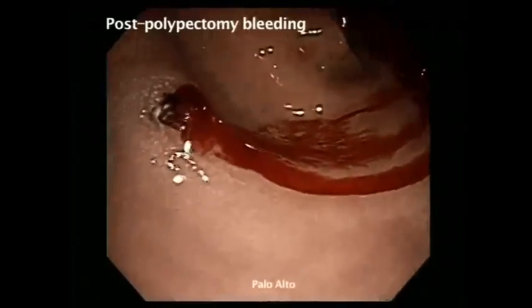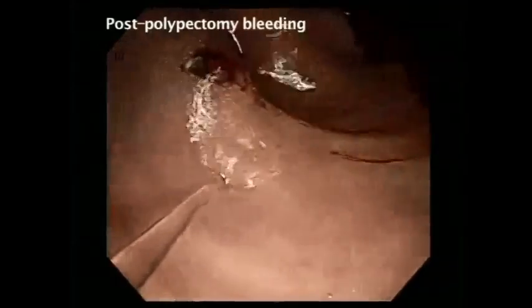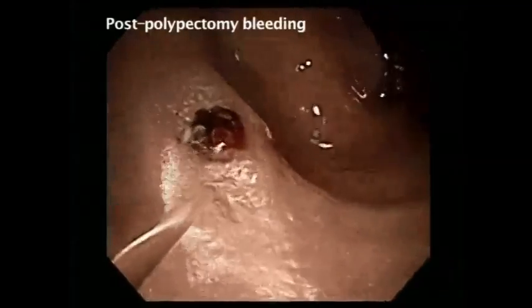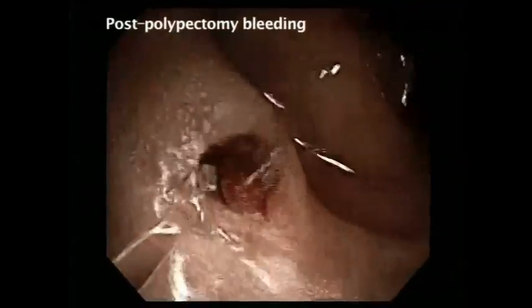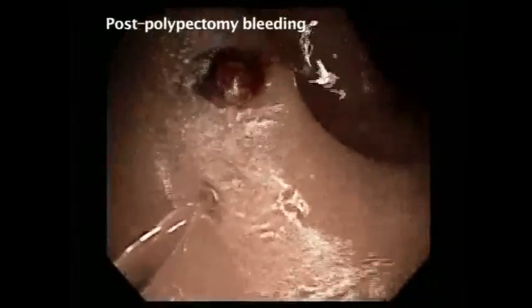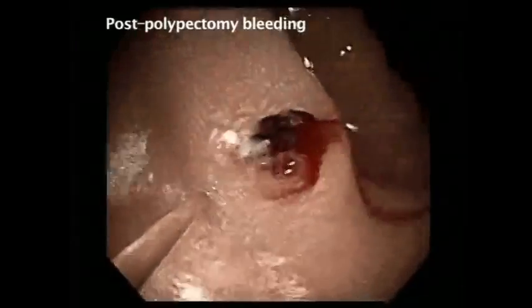Active bleeding can be seen at a polypectomy site in the rectosigmoid colon. With continuous washing, a visible vessel can be seen at the periphery of the resection site.